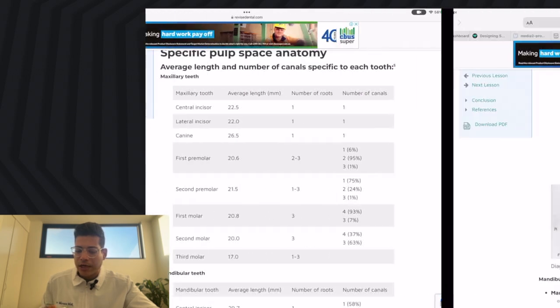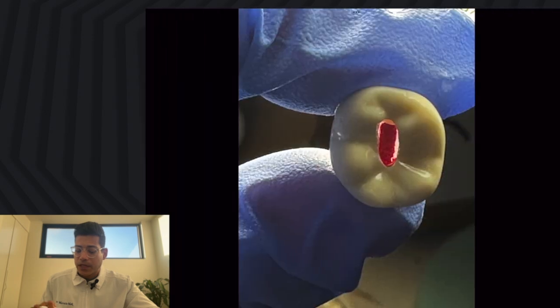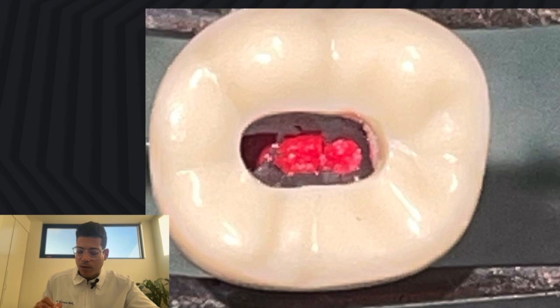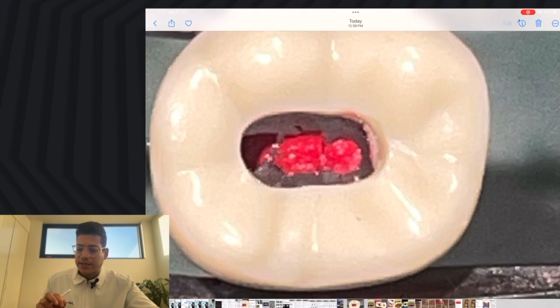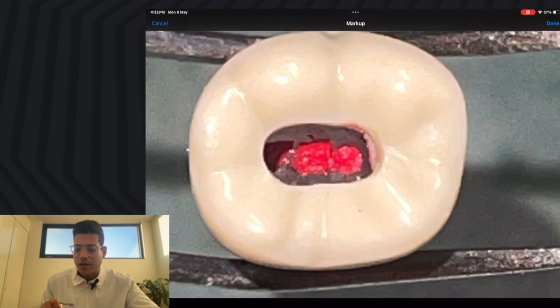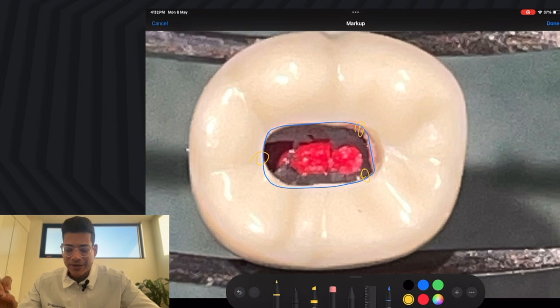You can look into the canal signs and everything, and you'll notice this is your molar endo. Now you'll notice the problem is when someone went in there, they predetermined and opened a bigger circle because they felt like they're going to get a rectangle or a triangle. So they already opened big canals right there. But what happened? The canal was small. The canal was joined together.